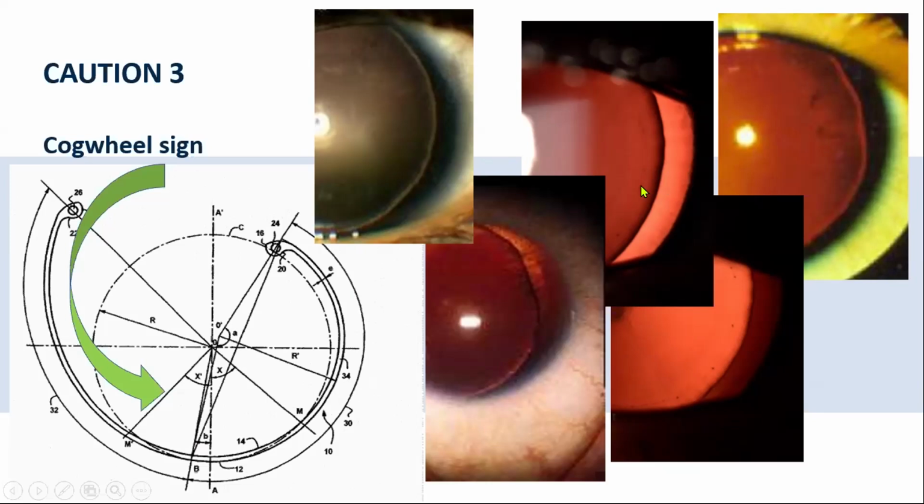The reason for this is that the equator is never so even, so smooth. So you may find some difficulties during the implantation. Do not worry.